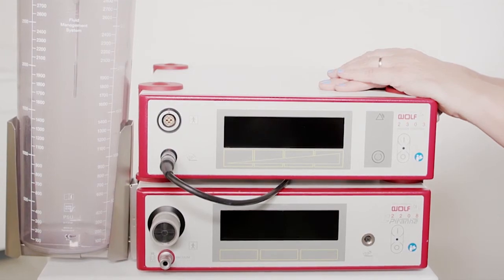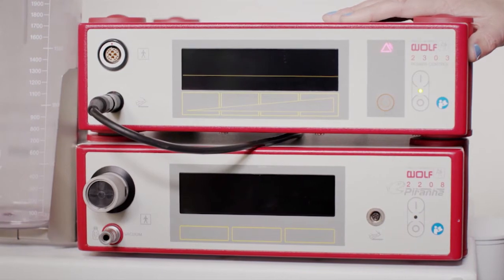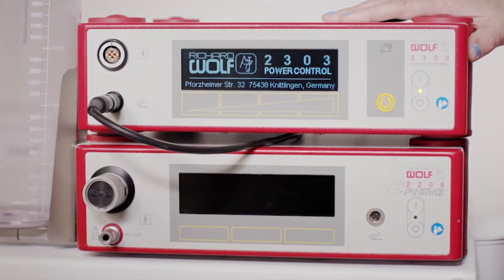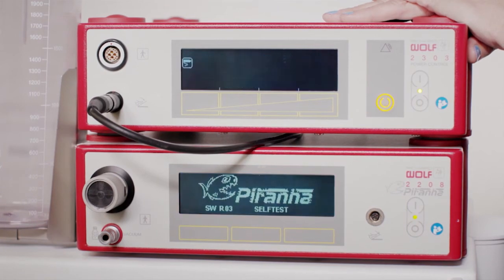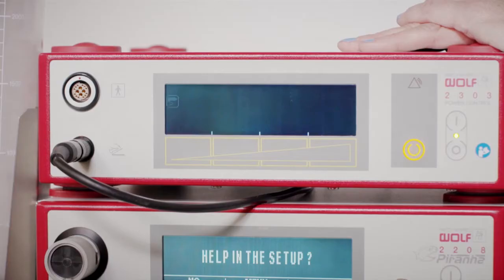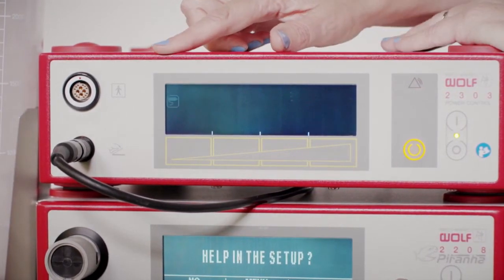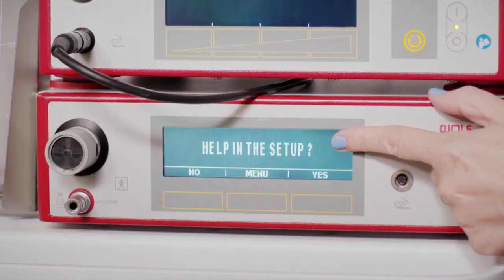Both units must be connected to a power outlet. Power on the motor unit, and then the suction pump unit. As the units power on, each will perform a calibration self-test. The motor unit will have a flashing power stick on the left side of the screen, indicating a power stick is not yet connected.